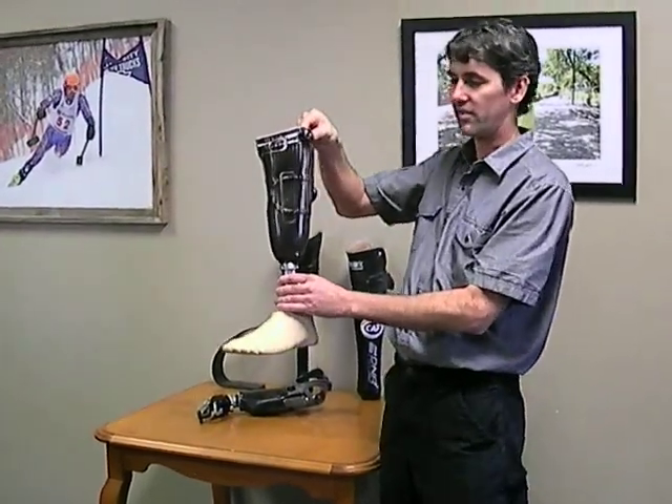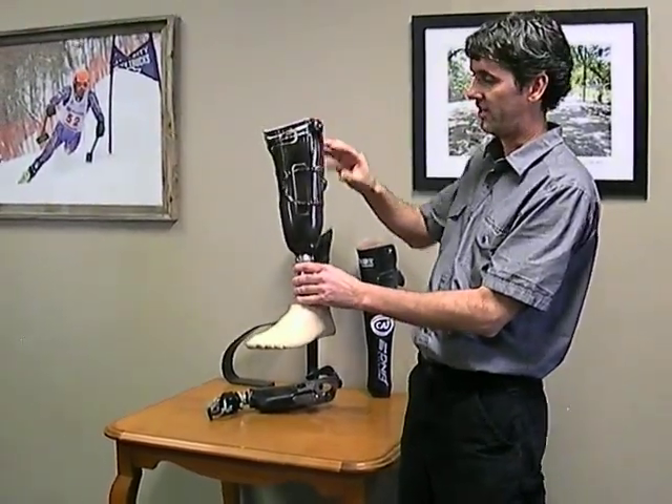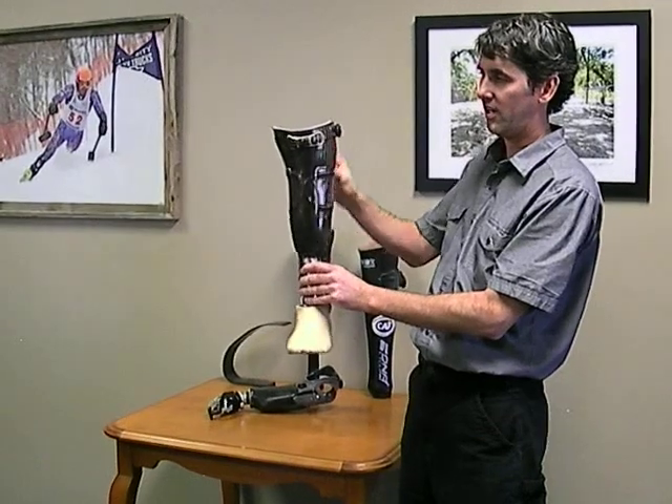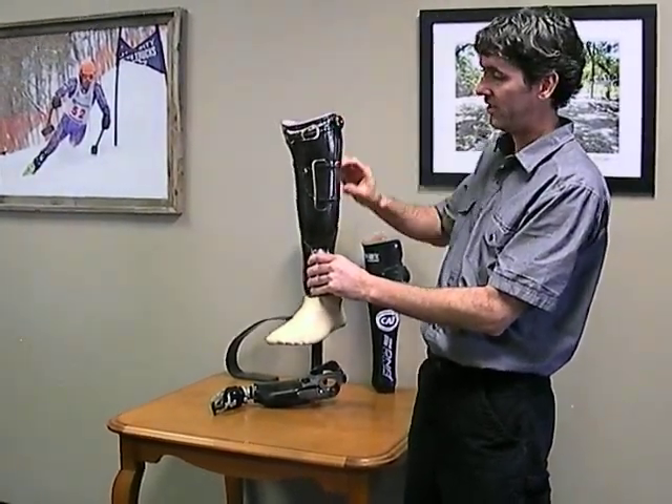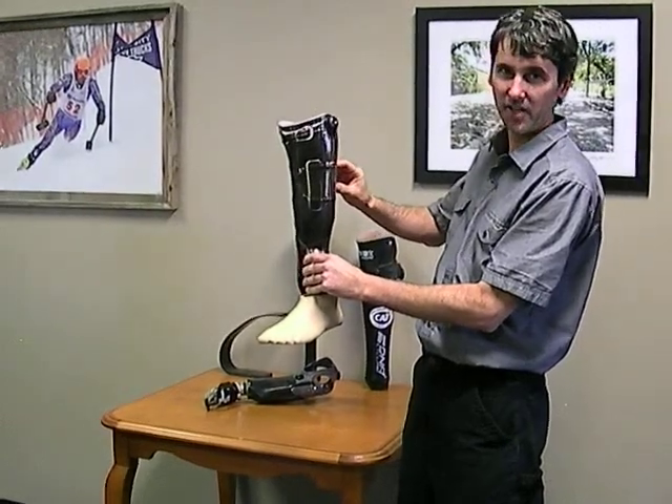This is the RevoFit dual zone. It's got a zone here in the middle, then it's got the upper zone in the patellar tendon area. They both adjust independently of each other.